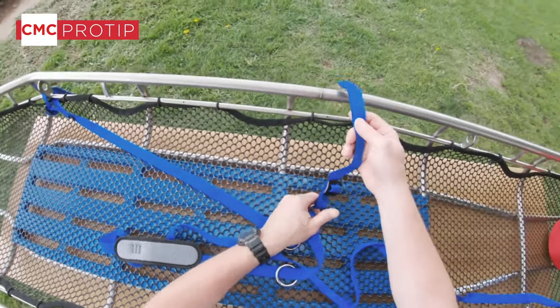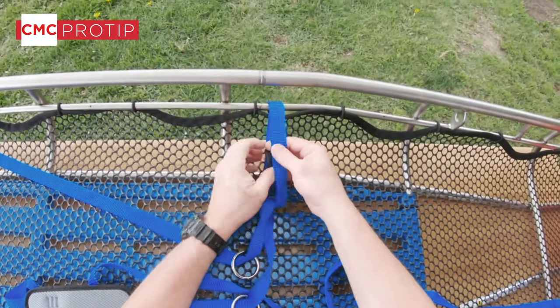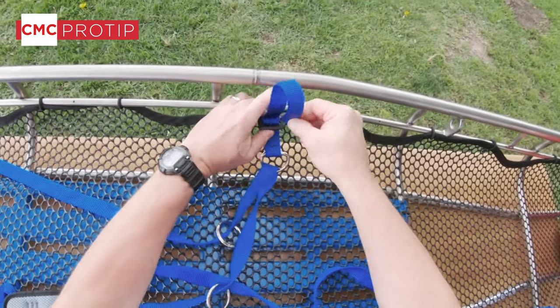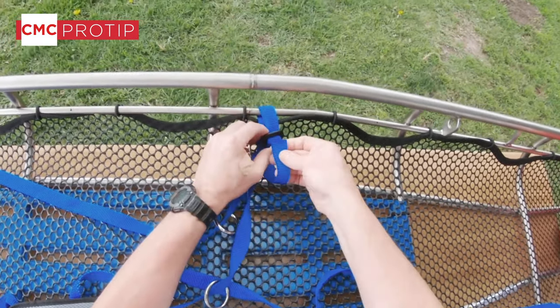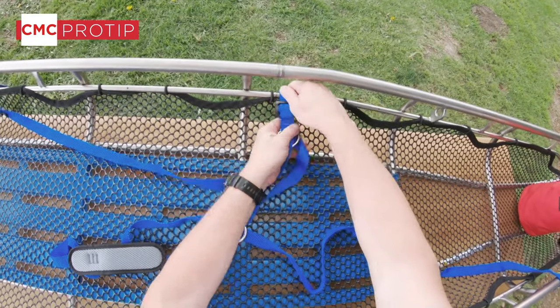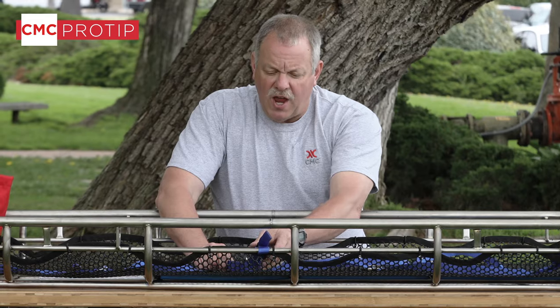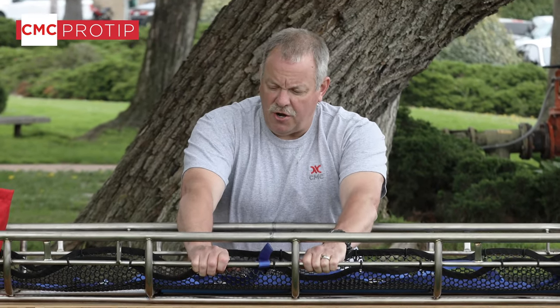Our second point is right here at roughly the waist height of the patient. This particular basket is a one-piece basket and we are using the one-piece tie-in system. If you have a break-apart basket there is a two-piece tie-in system, where basically each half would be split — one would end here and start here.